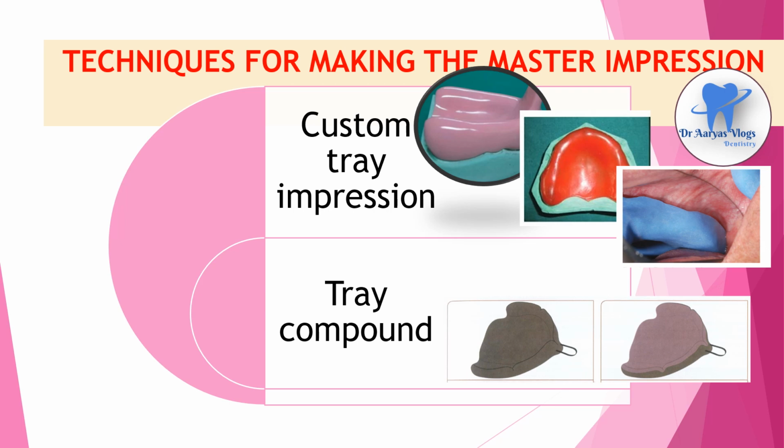And using tray compound, primary impression is made. And this impression is refined and trimmed to avoid overextension. And a metal wire is attached to it to act as a handle. Now the tray compound acts as the custom tray. Border molding and wash impressions are made over this set primary impression. Actually, we have all learned this in detail in the previous lecture. You can watch that video.